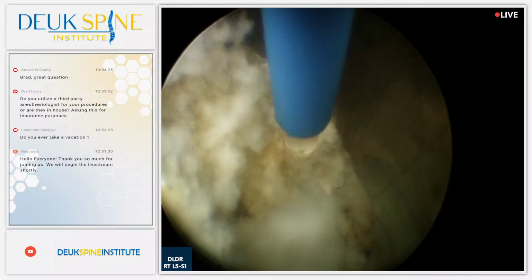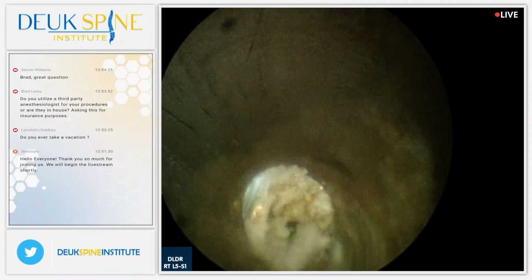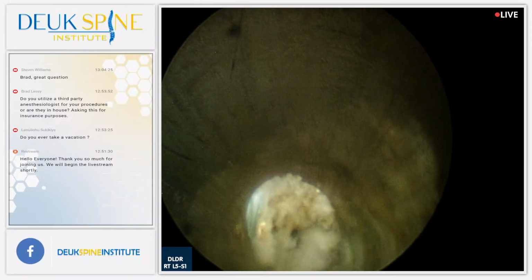Now, Henry, have we shown the audience yet how the Deuk laser disc repair works? Yes, we did. Yes, we have. All right, very good. So we've talked about the disc.